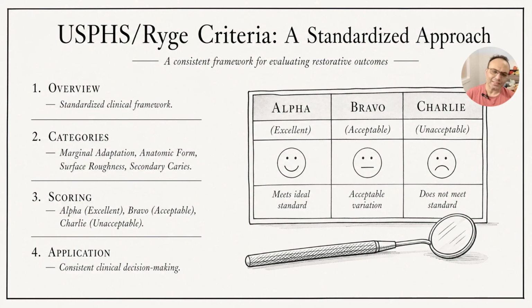or if it has some flaws, but it is still clinically acceptable, since it is not going to affect the restoration or longevity, they would let you get away with those couple of flaws, so it becomes acceptable. Or there are one or multiple flaws that are so detrimental or so bad that the restoration will not last for much and seriously requires replacement. So it will help evaluators decide how to grade you, or whether the restoration is not good enough at all.